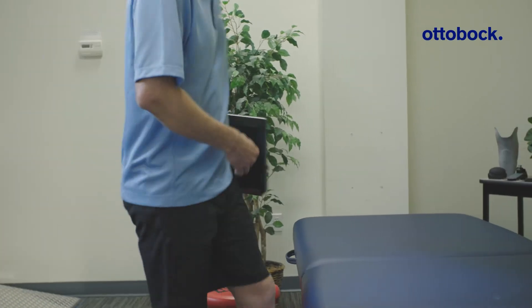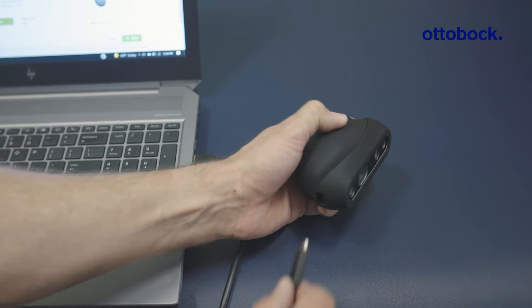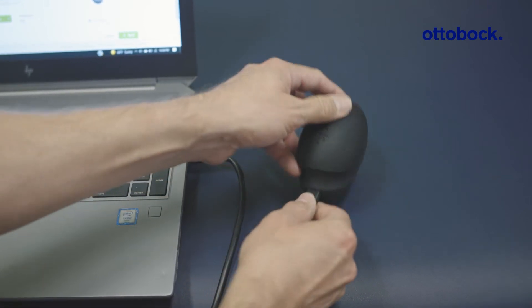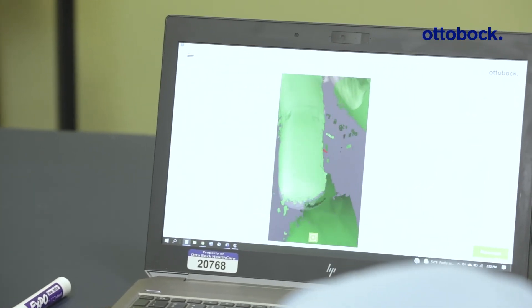The portability of the easy scan app and scanner device is wonderful because now you can enter your patient's home or a skilled care facility and capture their limb shape without hauling materials such as plaster and making a mess in their homes.